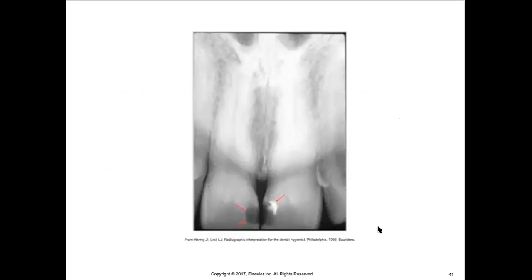So here we see a representation of what may look like caries. This, however, is not caries. There is some type of composites that are known as radiolucent composites. They do not appear on an X-ray. And so here we can tell that it is not a decay because of how well defined and shaped this is. You could tell that this was shaped very carefully by a dentist with a dental drill. And we have nice smooth margins all the way around.